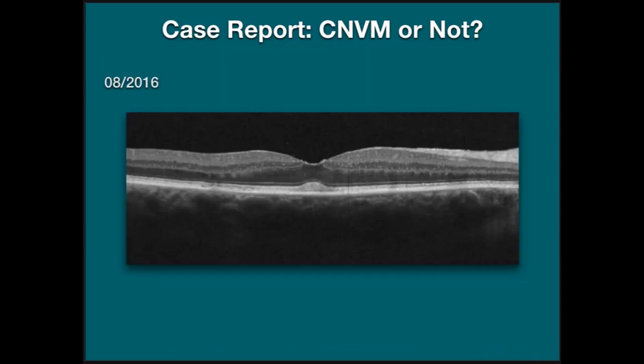So I reviewed the patient. This is his image in August. We can still see a little bit of a PED under the fovea, but all the intraretinal edema has subsided. He wasn't put on any treatment, no topical NSAIDs or steroids. We just let him be, and gradually he resolved on his own and his vision returned back to normal.